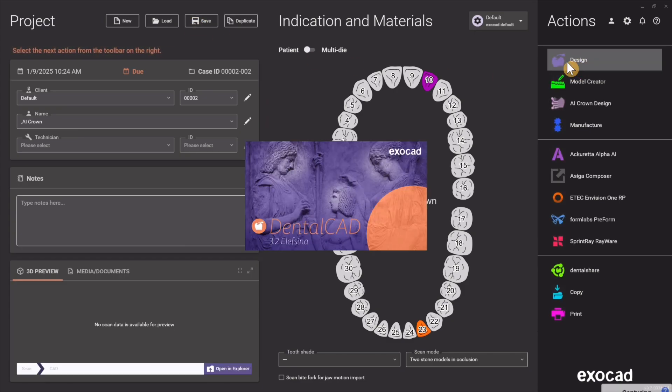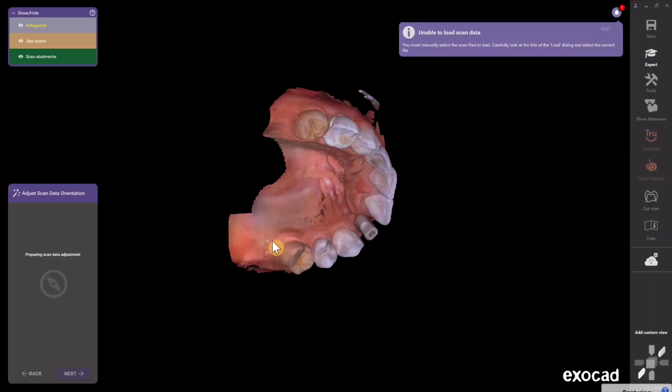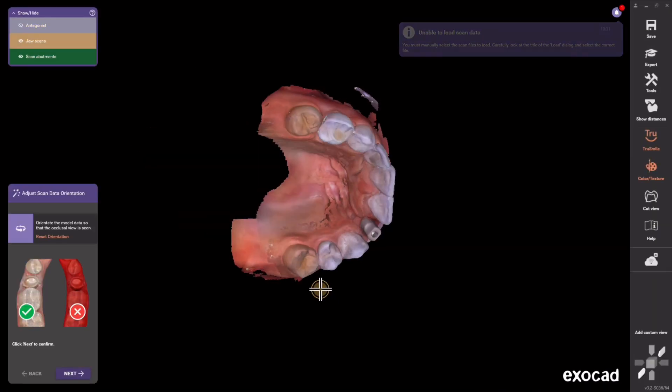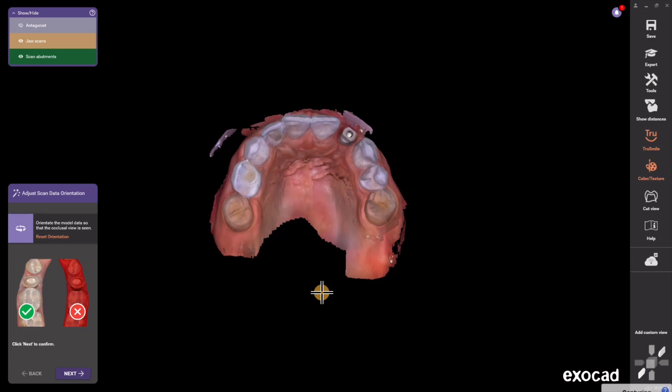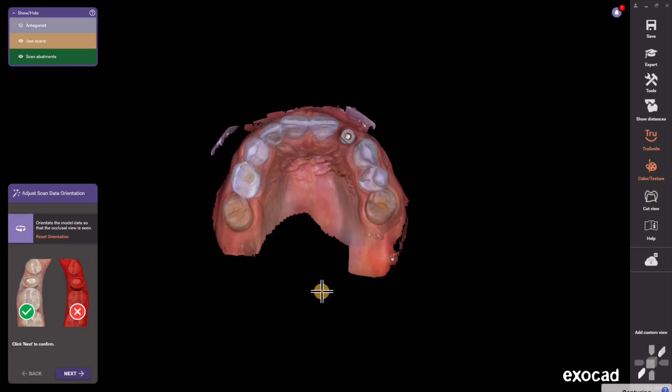The first thing Exocad is going to want is your scan files. Now if you're scanning with iTero Lumina or another type of scanner that's fully integrated, they'll just come right in. You won't have to find them, but in this case I loaded them up.